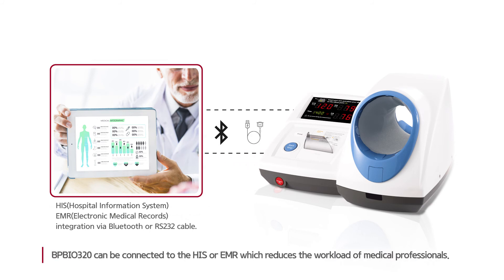BPBio320 can be connected to the HIS or EMR, which reduces the workload of medical professionals.